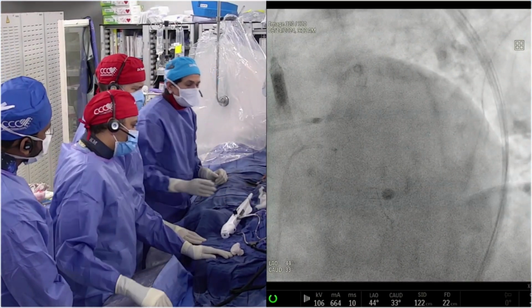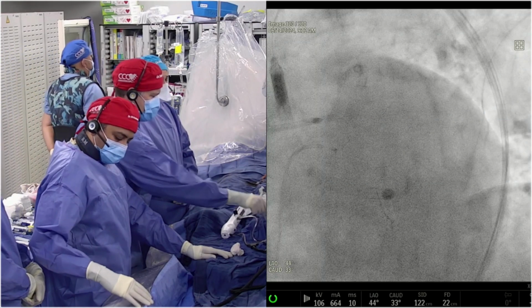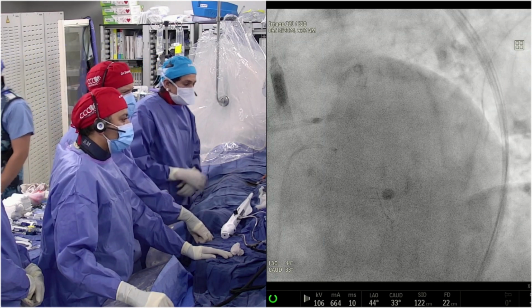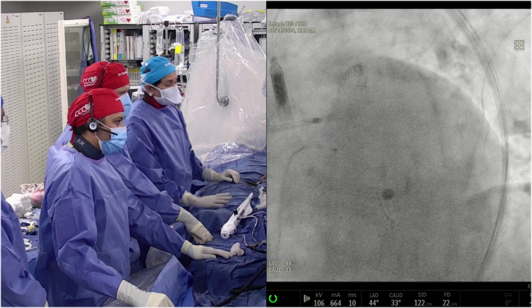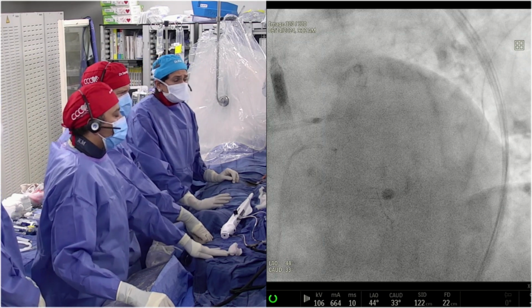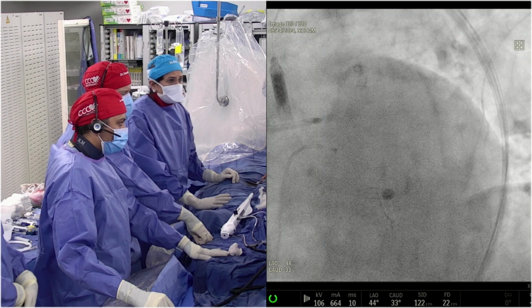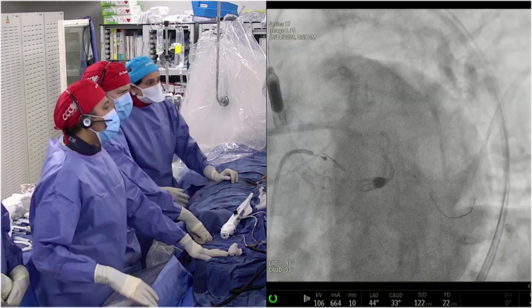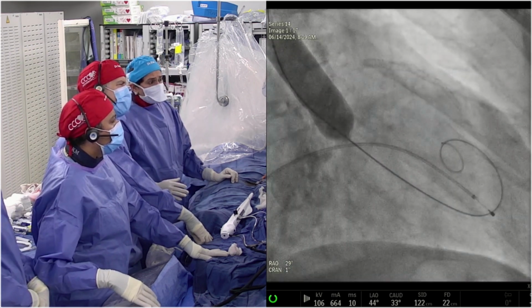Dr. said we agreed with all the panelist discussion. Of course, you know that this is a calcified patient with end-stage renal disease. So we did decide we were going to do rotational atherectomy of the left main to LAD. So we did do some imaging. We can quickly show both the imaging of left main to LAD as well as to CIRC. CIRC, I know, was moderate disease, but we still quickly show the IVUS.